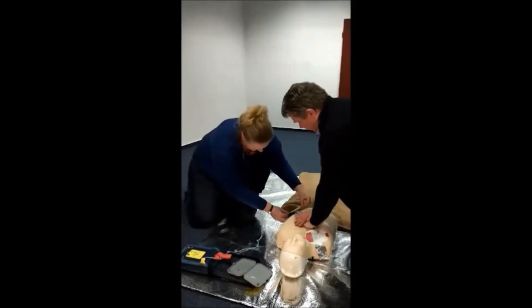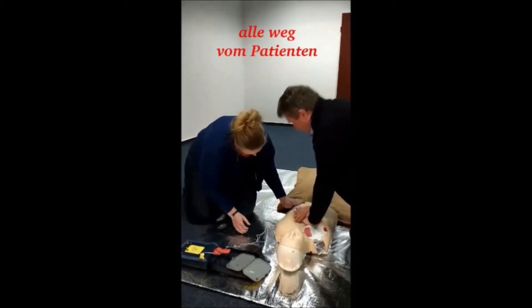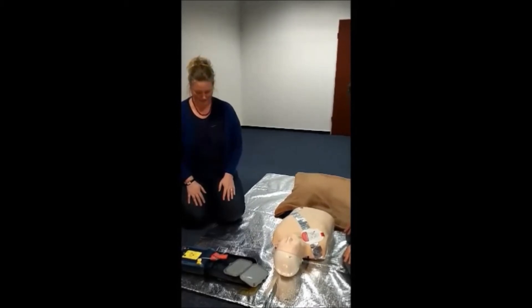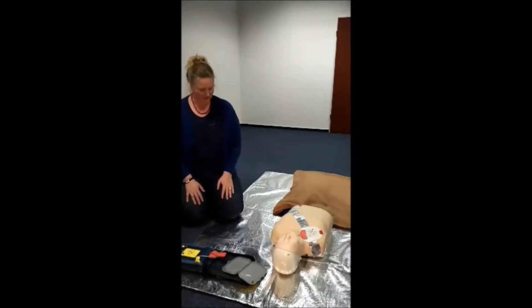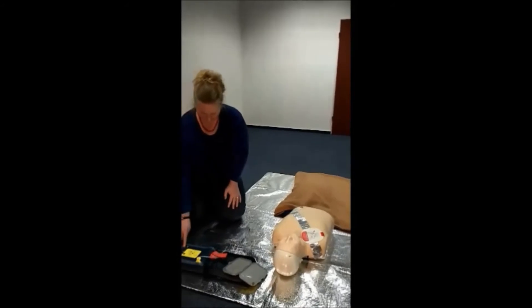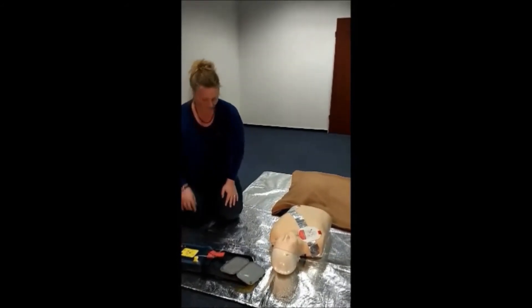Die zweite Elektrode abziehen und anlegen. Unbedingt Abstand vom Patienten halten. Herzrhythmus wird analysiert. Unbedingt Abstand vom Patienten halten. Schock empfohlen. Unbedingt Abstand vom Patienten halten. Orangefarbene Taste jetzt drücken. Alle weg vom Patienten. Schock abgegeben.